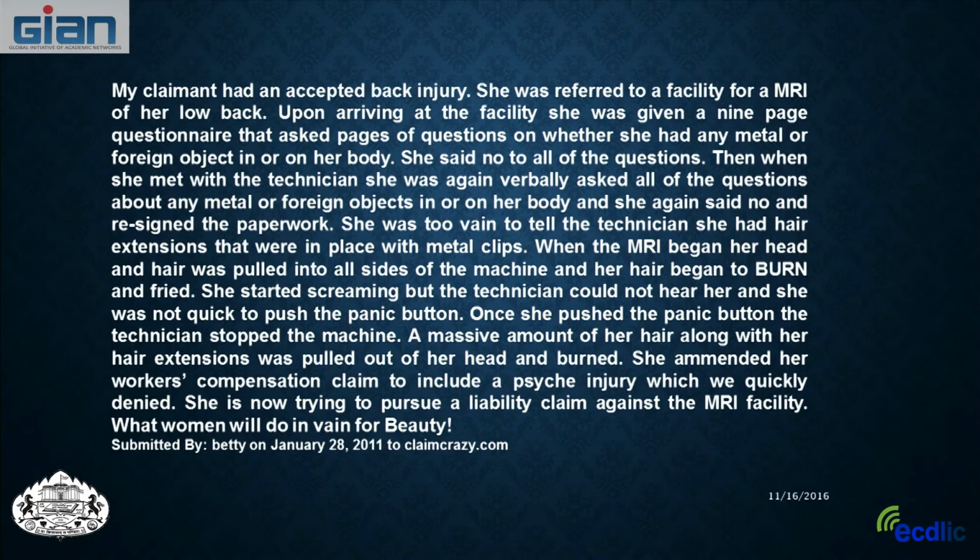She was not quick to push the panic button or squeeze the alarm, but once she did, the machine was stopped. And so a massive amount of her hair, along with her hair extensions, was pulled out of her head, and she suffered burns from these. So she sued the hospital in this case. And it says at the bottom here, what women will do in vain for beauty.